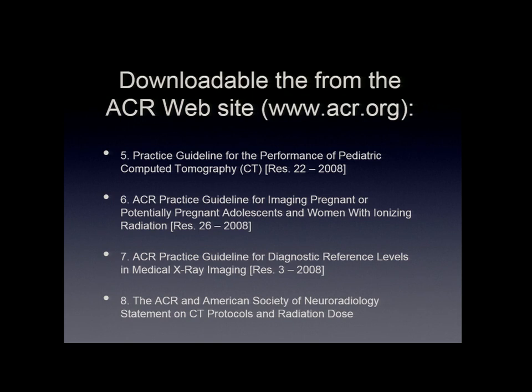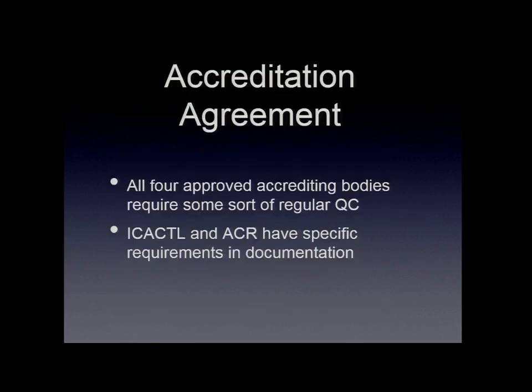So there's guidelines there. Diagnostic reference levels, that publication is in there. A lot of stuff was taken from NCRP 172 to help that, as well as the accreditation program. So you can get this stuff on the website. A lot of that came from that, since I do a lot of ACR accreditation.